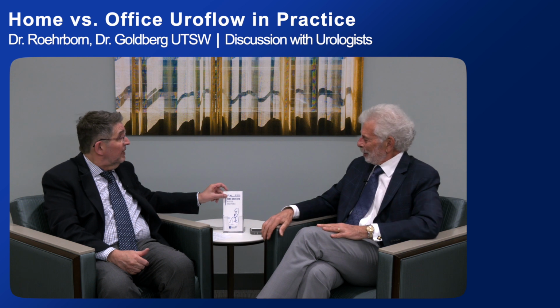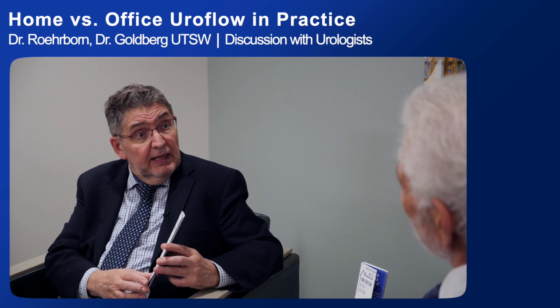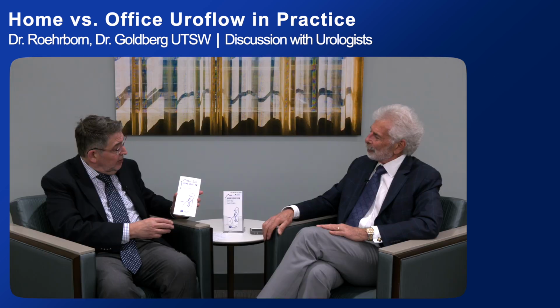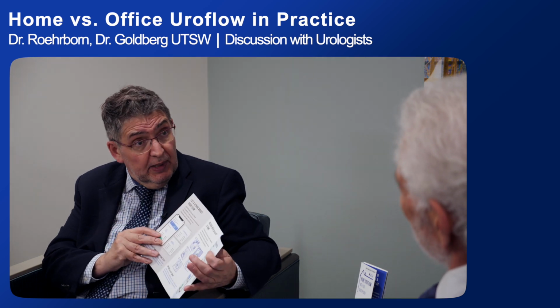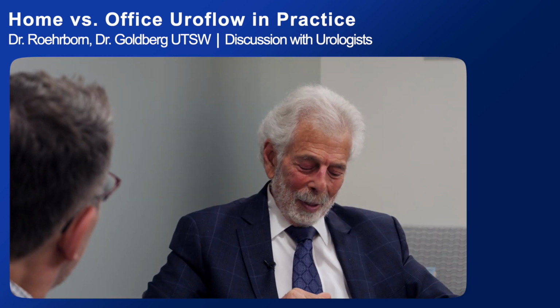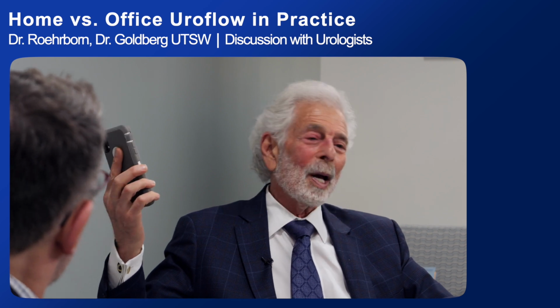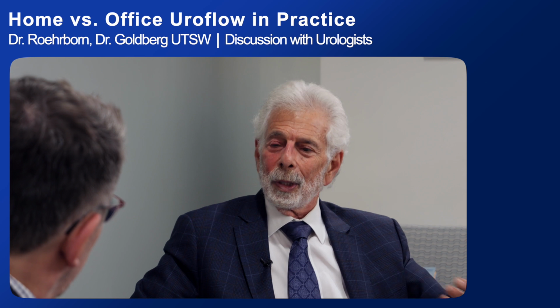And I think this is basically what this little brochure talks about. So this is an app, if I understand it. There is not really a device associated with it, called ProudP. And the patient takes this home. It comes with instructions on how to use it. And they have to have an app on their phone, right? Correct. And in fact, I have an app for the ProudP. It's very simple. They download the app. They register for the urologist that they're seeing.